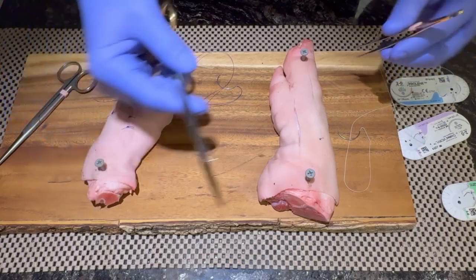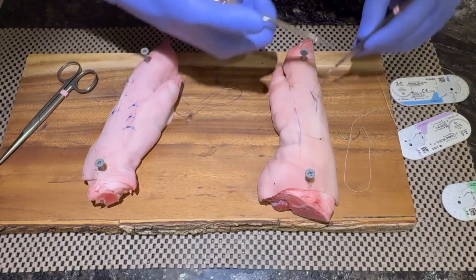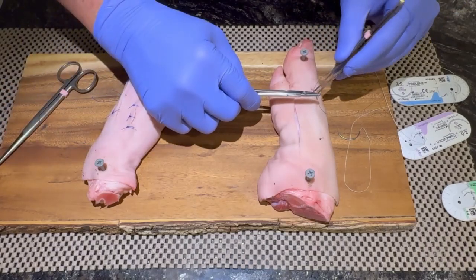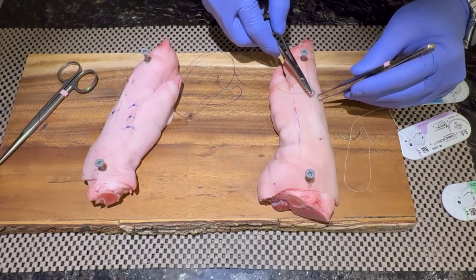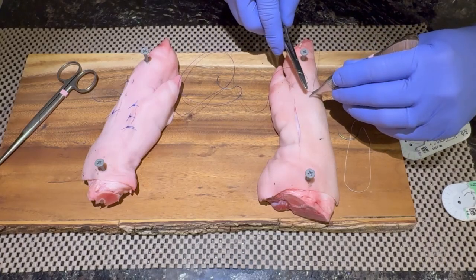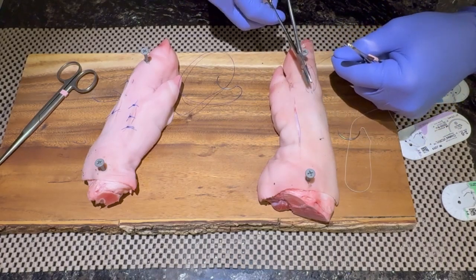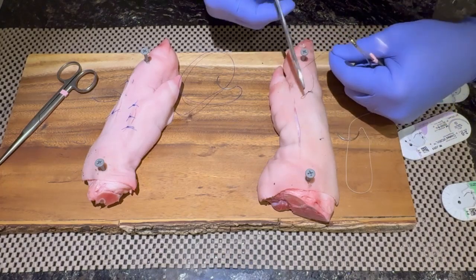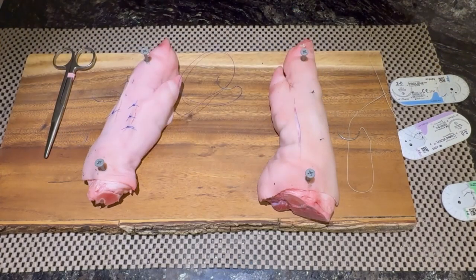Grab the needle at the back three quarters, pull very superficial to the skin, twist the wrist, get the tip out, grab it with the pickup and pull it through. And like this, we can have a very clean and nice suturing. At the end of the suture, you can just go out to one side and finish with our simple knot. 2 loops on one side, you close it, 1 loop toward the counter loop, and another loop. That should suffice for the skin, and we're going to have a clean and aesthetic suture.